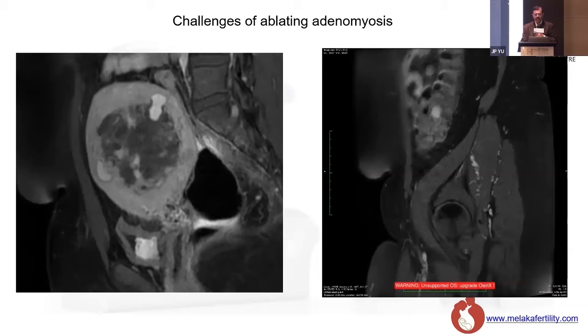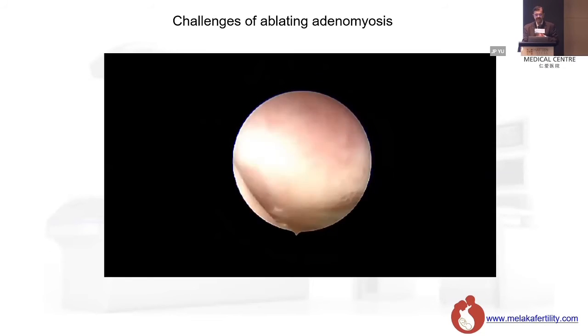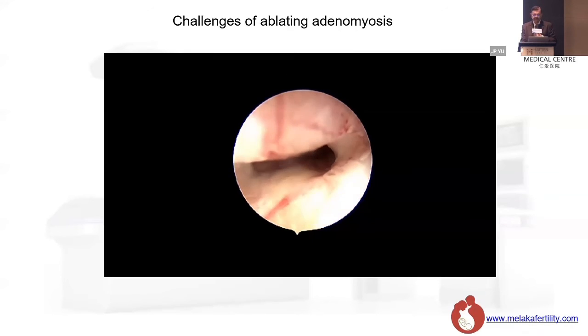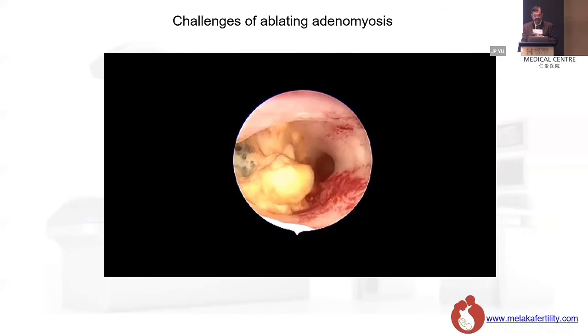And I can show you an example of a hysteroscopy that I've done for such a patient just now. This is the hysteroscopy done 3 months later. She's single, she's a doctor, she's about 38, 39, no partner. Then I have to put in a Mirena for her. So I took her to OT and did a hysteroscopy.